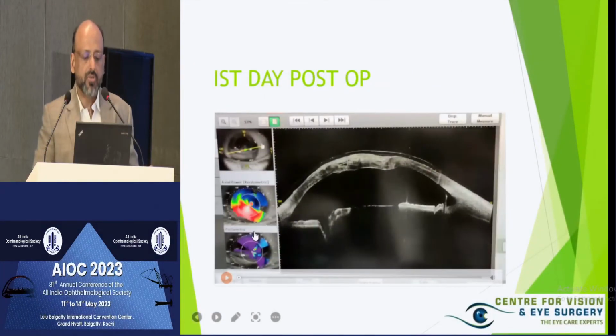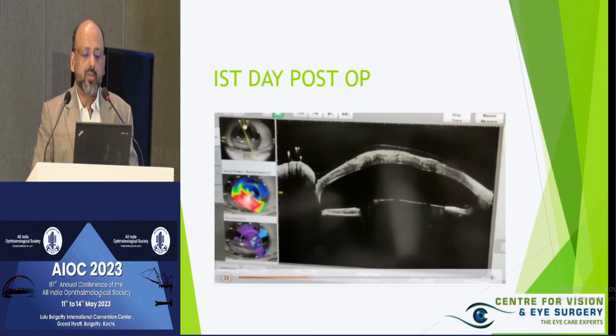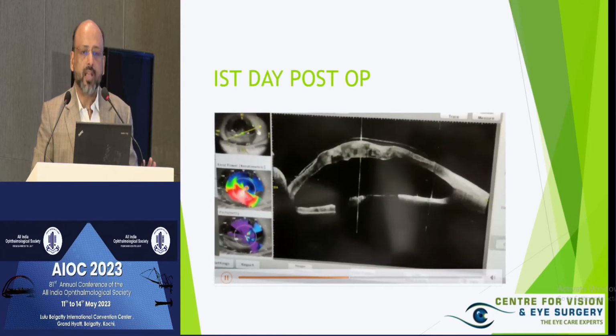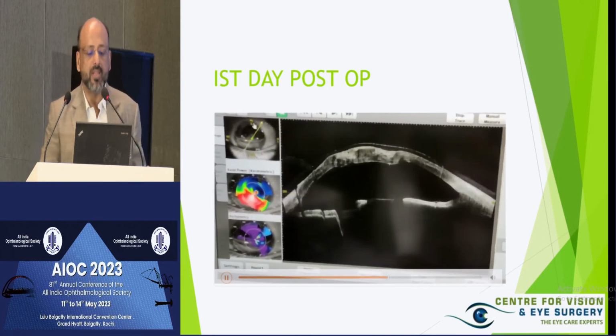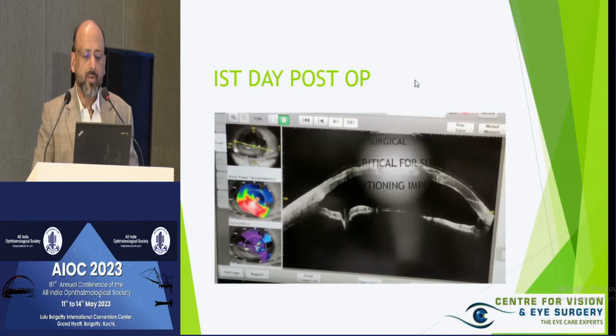This is just to show the first day post-op of the OCT. You can make out there is absolutely no Descemet's detachment now. The stroma has actually become very compressed, and the patient's vision also tends to be quite good.